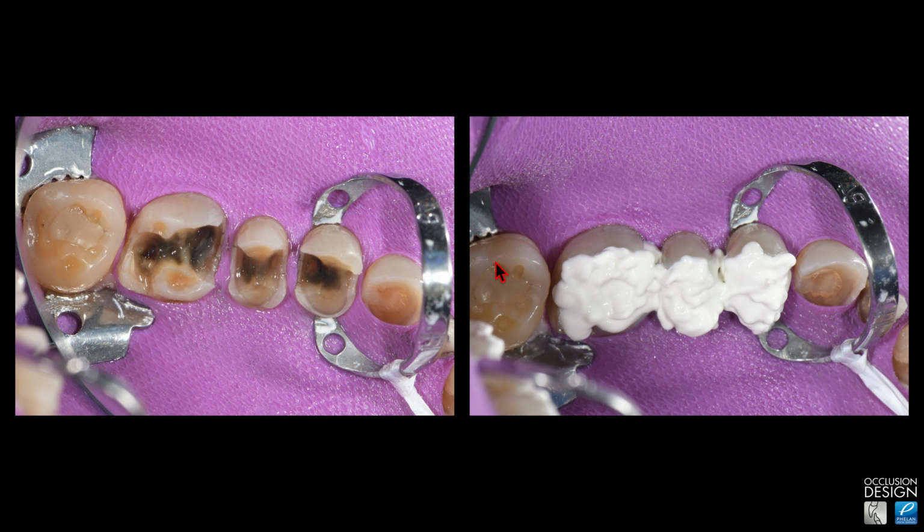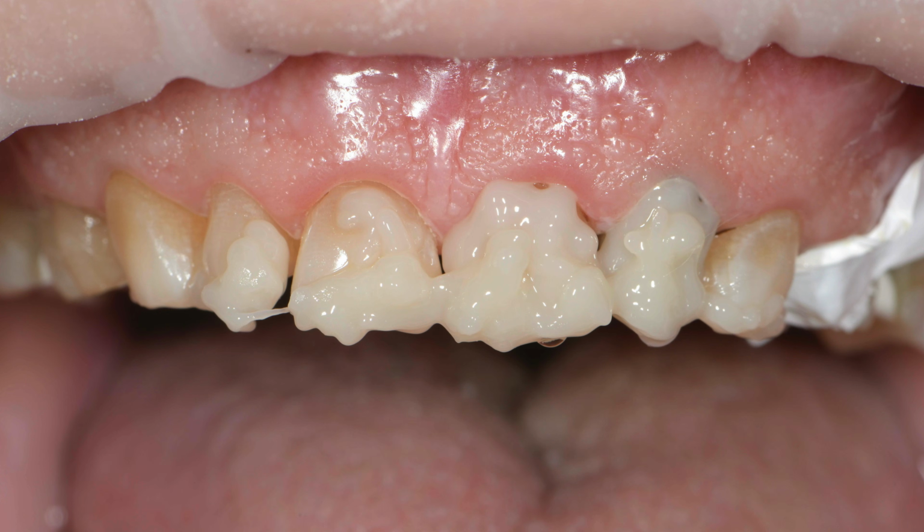This composite resin and the opposing other side's composite resin I did after the provisionals were in place, because then I know how much to build up the occlusion on it, since we were obviously opening the vertical dimension for this patient. And then I do the preps and the buildups and everything in quadrants. So I do the posterior, then the other posterior, then the anterior. It helps me manage freezing as well.